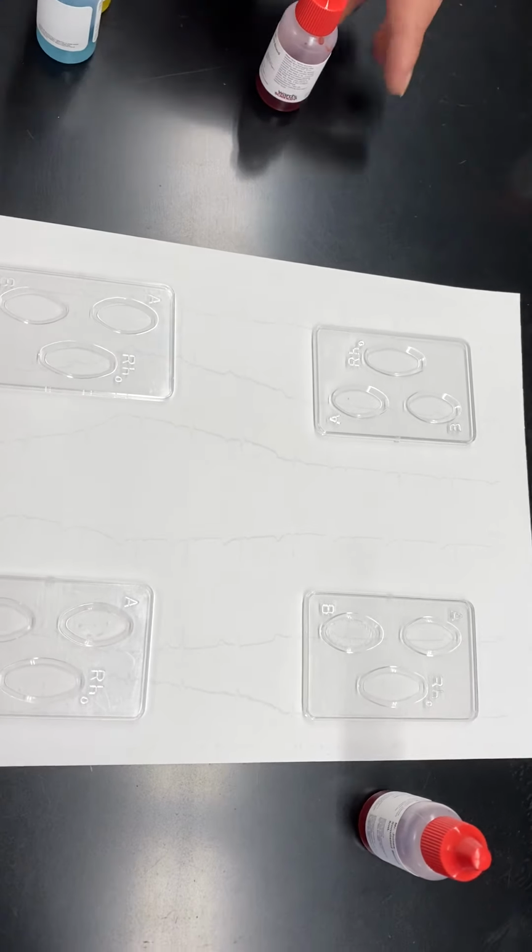So right here you have 3 different solutions. If you read the label, and I don't know if you can see them, it says simulated anti-A serum. What that means is basically this is a man-made anti-A antibody. This one says simulated anti-B serum, which means this is a man-made anti-B antibody.